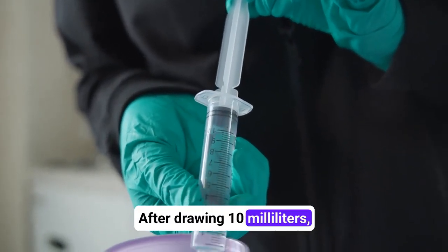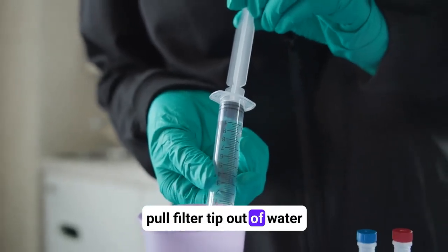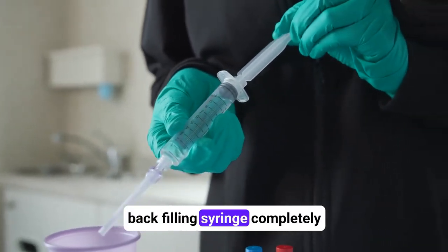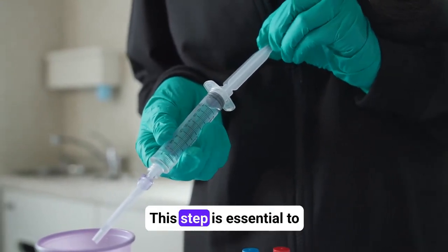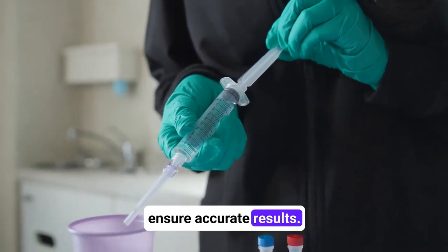After drawing 10 milliliters, pull filter tip out of water sample, and then pull plunger back, filling syringe completely with air. This step is essential to ensure accurate results.